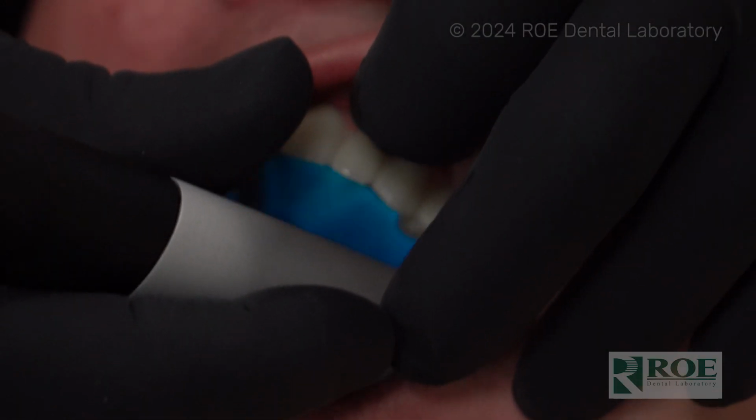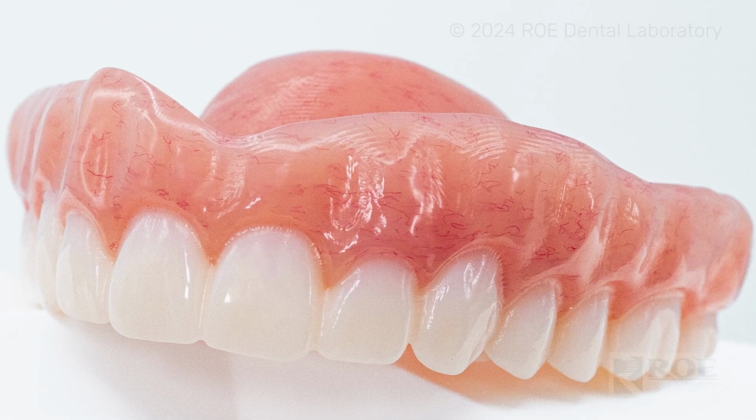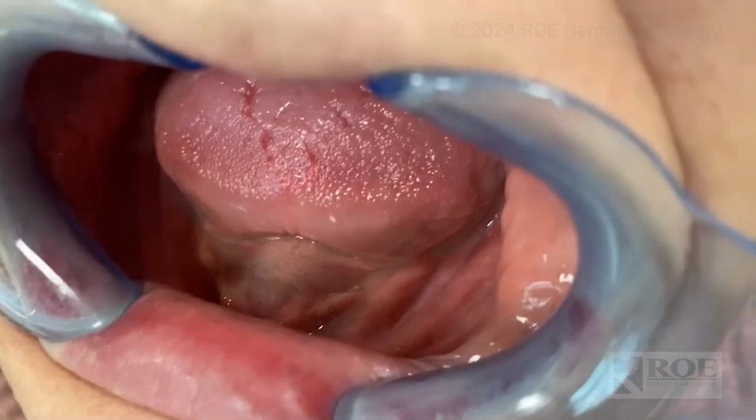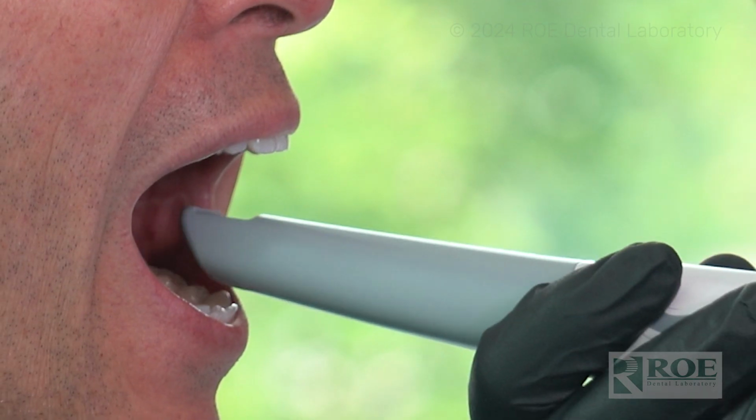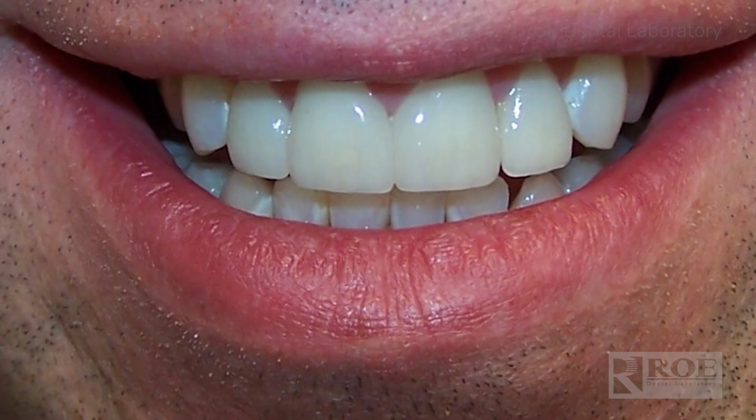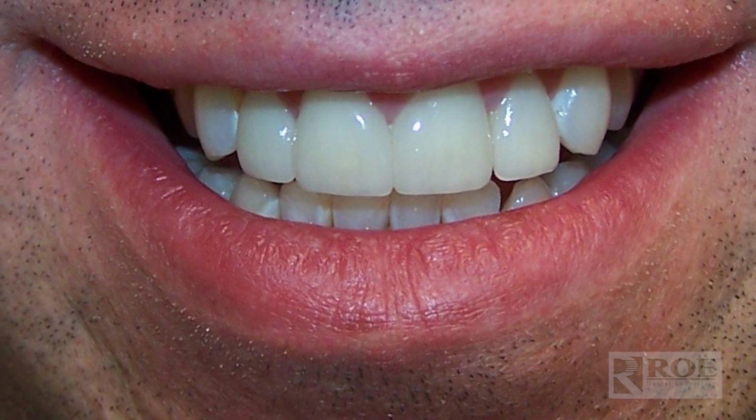So no matter if your patient is presenting from a stance where they're dentate and looking to have an immediate digital denture done, or edentulous, we always want impressions, obviously, PVS, alginate, IOS scans, and a series of photos once we get the bite block returned back to you, or from the dentate stage. If the patient presents with dentate, we want full face, full smile photos, exaggerated smile, and then your scans.